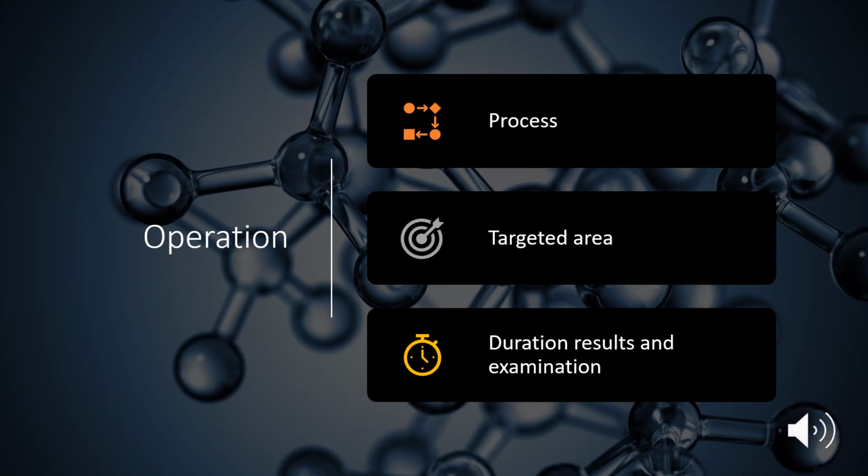Targeting area. The purpose of having a CT scan is to help detect what is inside the body that a normal X-ray cannot determine, such as bones, tissue, and joints. Those are areas that CT scan is able to target better than a normal X-ray.